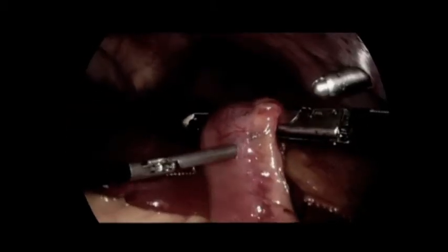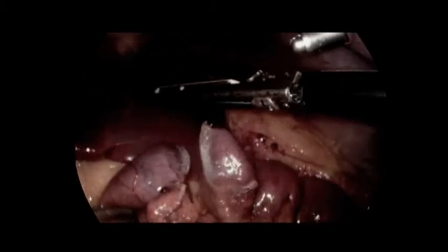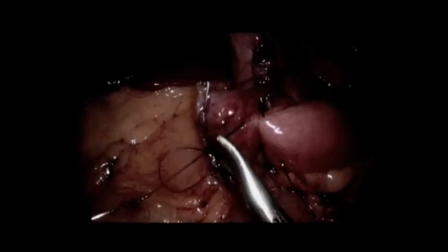As we felt that we had confirmed the anatomy, we then measured 50 centimeters from this point, and the small bowel was then divided in the routine fashion. We then proceeded with our creation of the enteroenterostomy, which was then sutured closed.